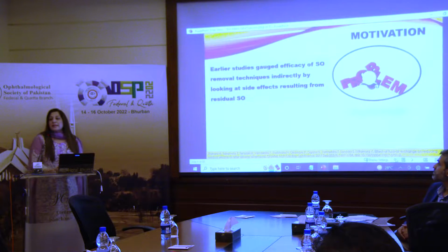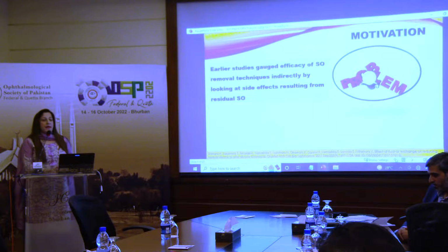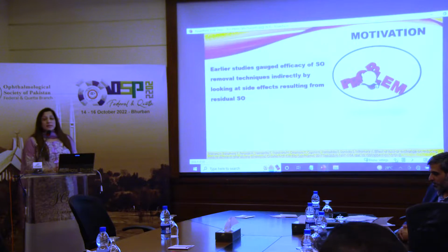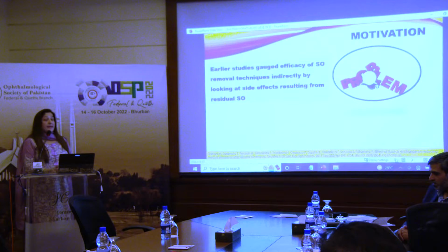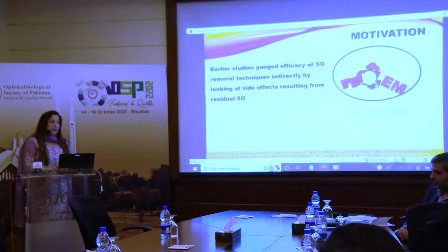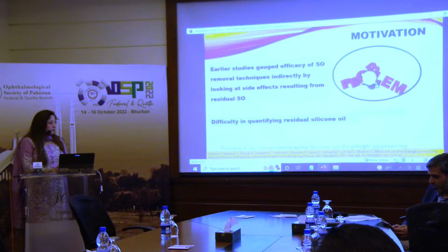There are different techniques for removal of silicone oil. Some are passive methods, some are active methods, some are manual, and many more. Earlier studies gauged the efficacy of silicone oil removal techniques indirectly by looking at side effects resulting from residual silicone oil droplets, probably because of difficulty in quantifying residual oil droplets.